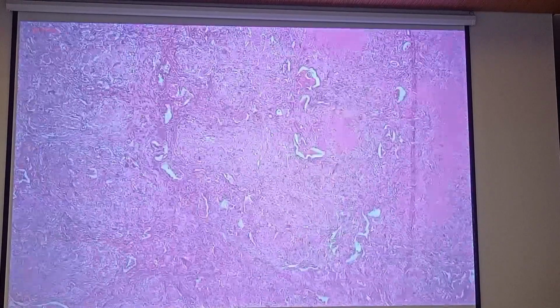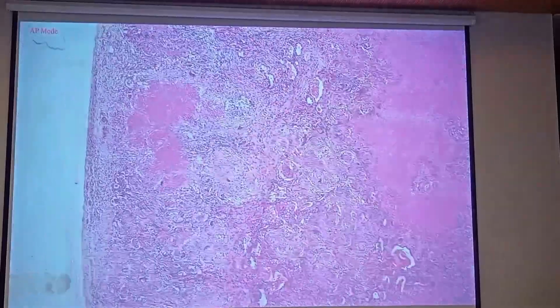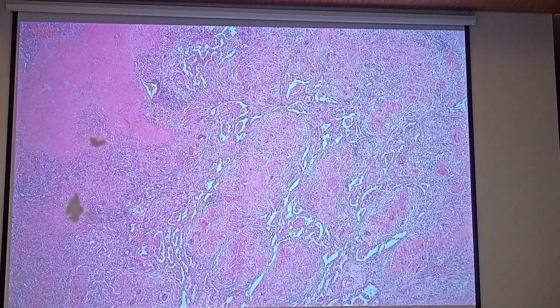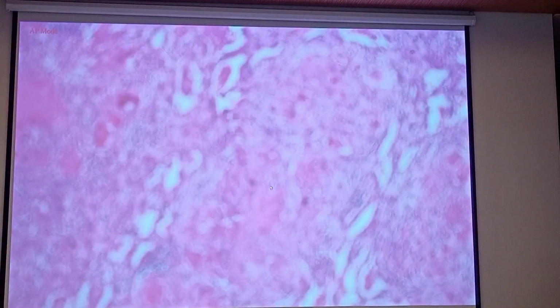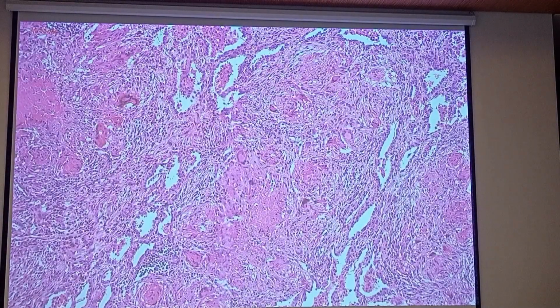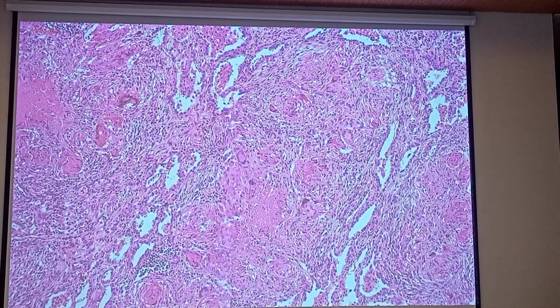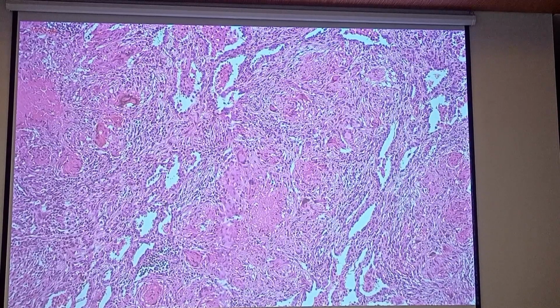Now if you look at the wall, let me just see if I can find a very good one here. This one. Let's look at it. Okay, so this is the middle part, caseous necrosis, followed by these spindle-shaped cells, which have the larger nucleus.